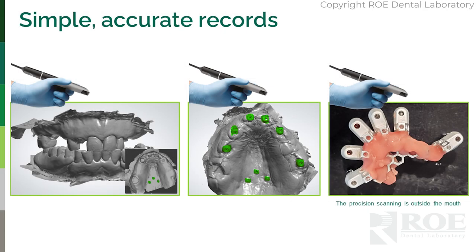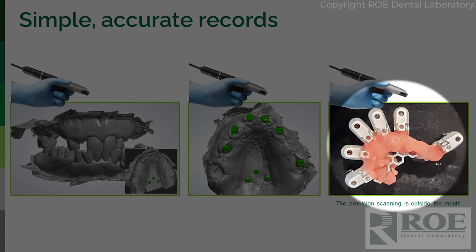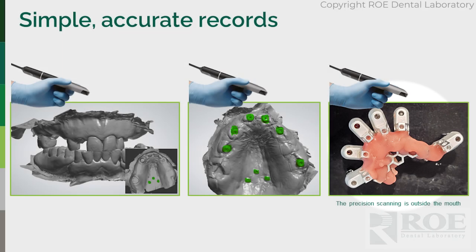The extraoral scan will be of the OptiSplint on a bench under a controlled environment with your IOS scanner. You don't have patient breath, you don't have blood moving, you don't have sutures, you don't have anything going on behind it or under it that's going to throw off the scanner. You're going to have a pure scan on the benchtop.